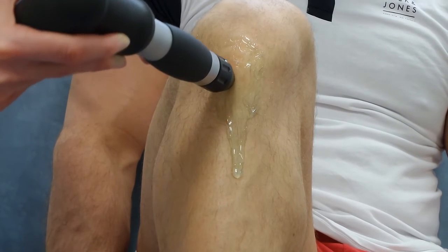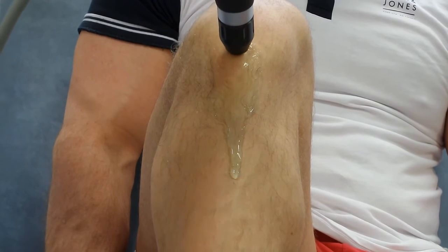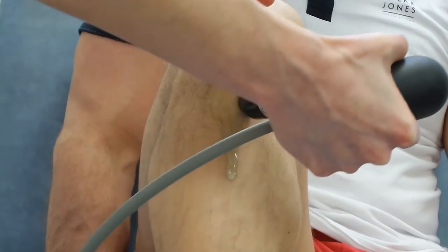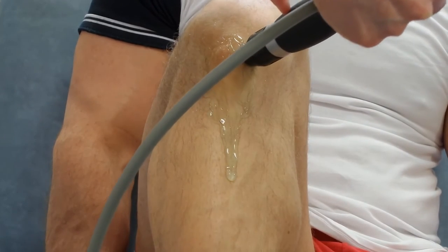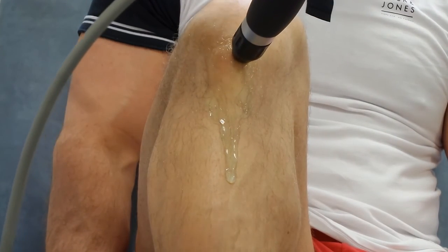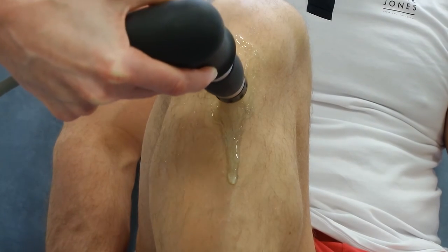If the area was smaller, like the bone spurs you get in the Achilles, the end of the Achilles or into the plantar fascia, you can just treat those as a single spot, and you'll see that in some of our other videos. In this case the area is too big to treat as a single spot. You could divide the area into smaller spots and do each one for a certain number of shocks. We've chosen not to do that in this case.